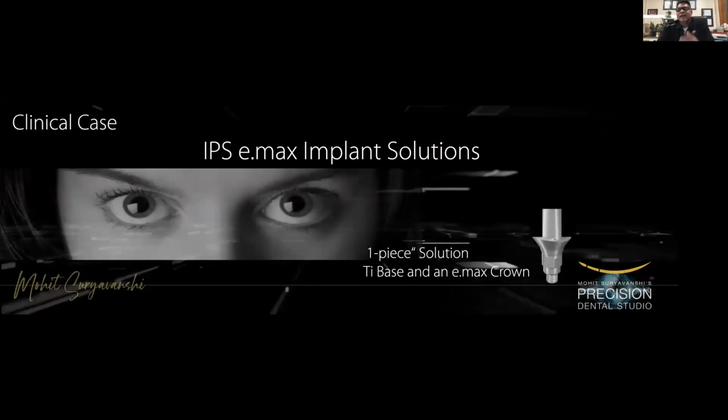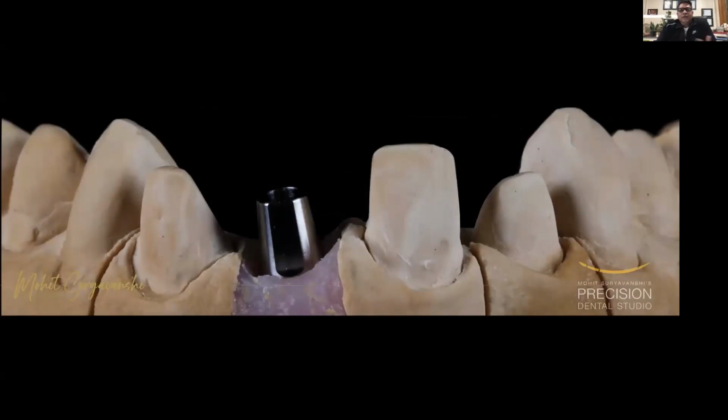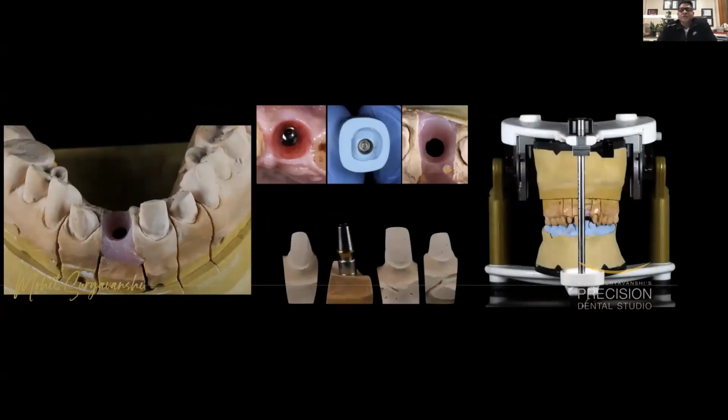There's one more case that I would like to show you, wherein there are diverse, very different restorations. There are crowns. There is an implant crown. The dentist has worked really well on the emergence profile. He has created a custom emergence profile, which we have recreated in the form of a model with the perfect gingival mask.